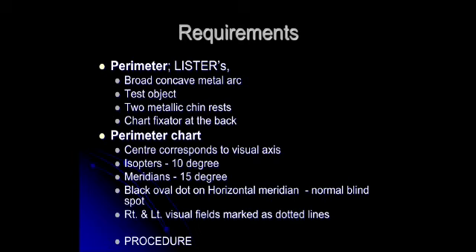When the field of vision of the right eye is to be tested, the subject should rest his chin on the left chin rest. This brings his right eye in line with the fixation point. Focus the eye to be examined on the fixed object, which is a white object of 5 mm size placed at the center of the metallic arc. It should be emphasized that the subject's gaze should be fixed at the object throughout the maneuver. Fix the metallic arc in one meridian.